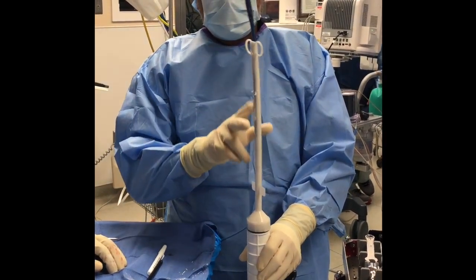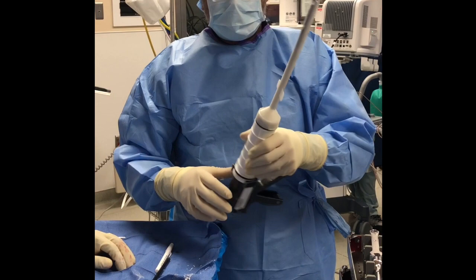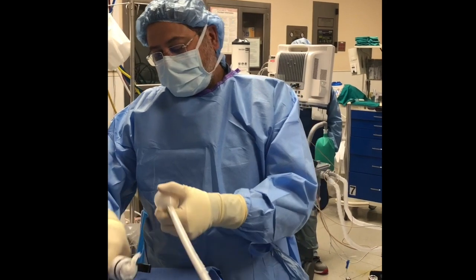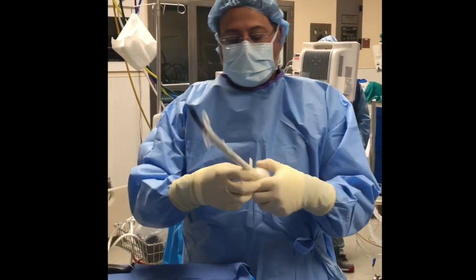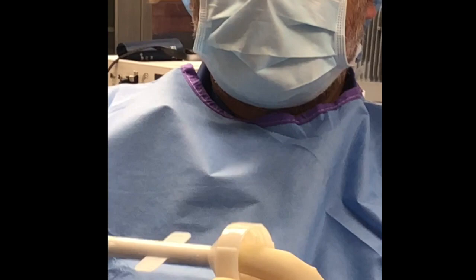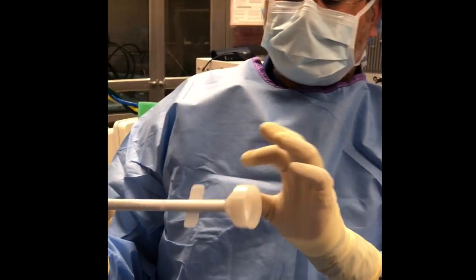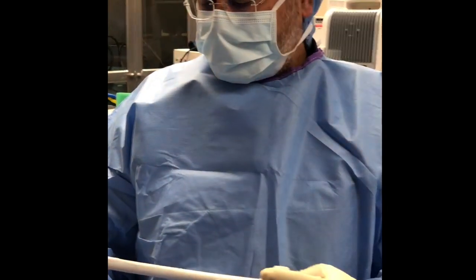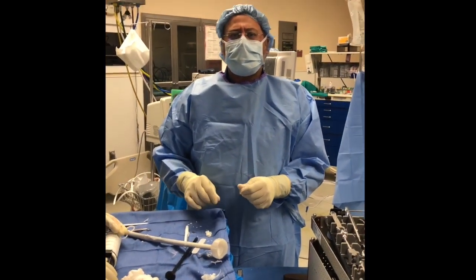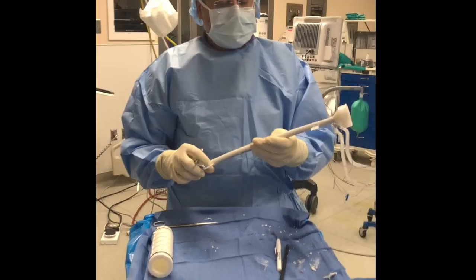It actually goes inside the nail. I'm not going to use a guide wire to push it through — I'm just going to wait. I'm just going to take this off and make sure that the nail isn't through — and it's not. The nail hasn't gone past the end, because if it goes past the end, sometimes it's a problem: the whole thing fills up with cement and then you have to break the cement off the nail. The nails we use are usually eight or nine millimeter, because the inner diameter of the tube is 11 — so it makes a perfect 11 millimeter nail.